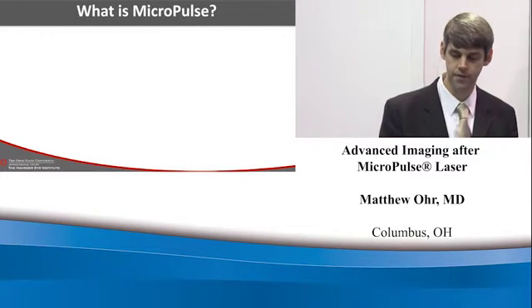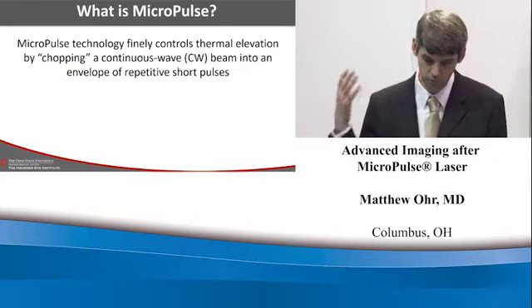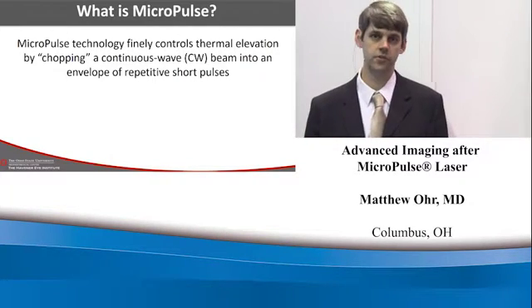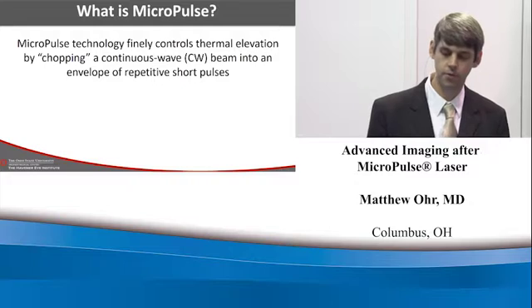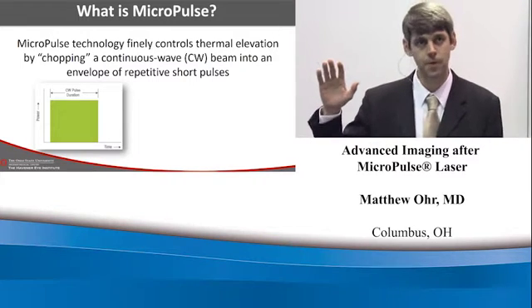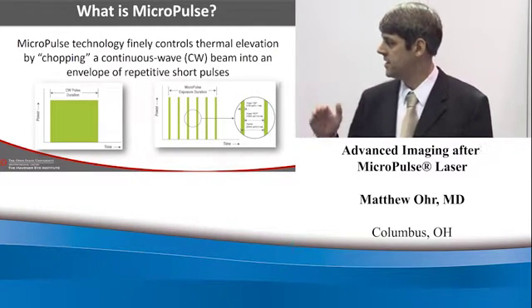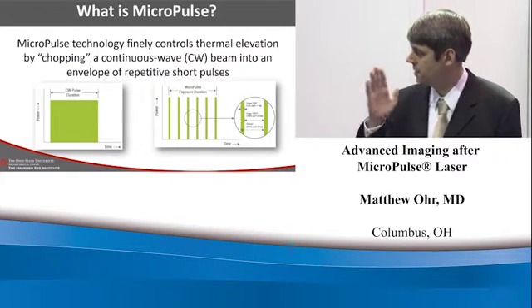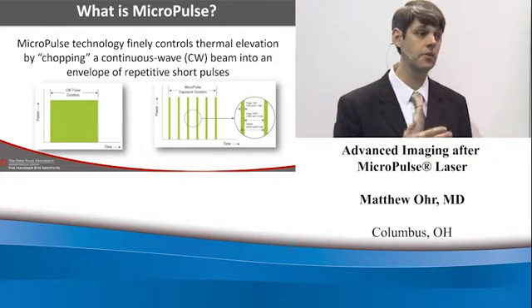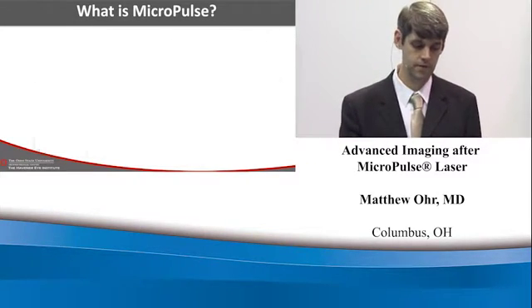The details of MicroPulse as it's described, and this is a concept that I think is worth thinking about, is the idea that what if we take a continuous wave and we chop it into small pulses? And if we deliver those pulses in a different way than traditional laser. So when we think about continuous wave traditional laser, this is what we think about. It's a beam, you push the pedal down, the beam is delivered continuously, and then the beam stops. MicroPulse focal laser cuts that beam into very, very small envelopes of treatment so that the laser is not truly on the entire time. And then actually most of the time, depending on your duty cycle, the laser itself is off. So you get these very small segments of treatment that are dosed accordingly.